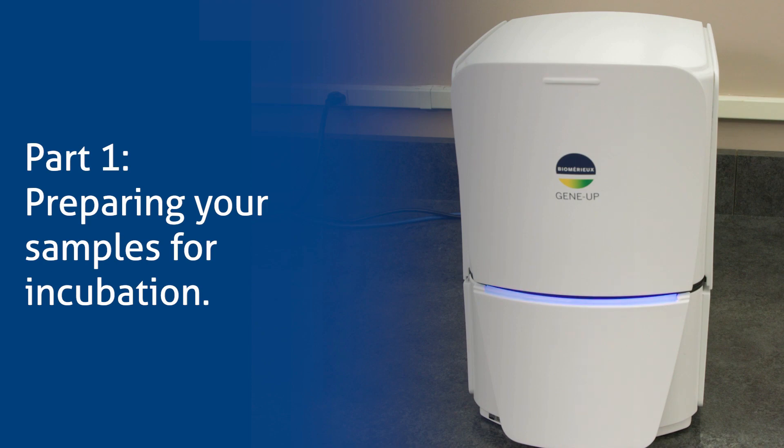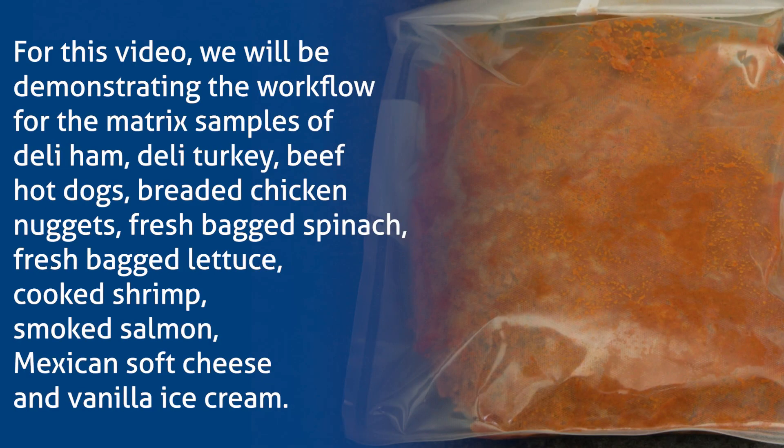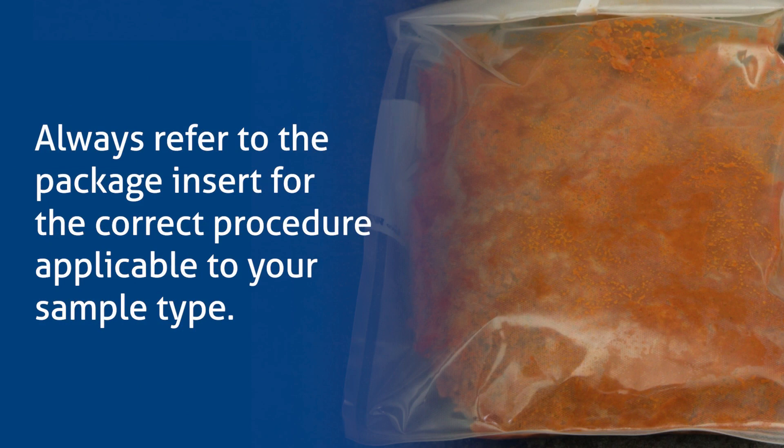Part 1: Preparing Your Samples for Incubation. For this video, we will be demonstrating the workflow for the matrix samples of deli ham, deli turkey, beef hot dogs, breaded chicken nuggets, fresh bagged spinach, fresh bagged lettuce, cooked shrimp, smoked salmon, Mexican soft cheese, and vanilla ice cream. Always refer to the package insert for the correct procedure applicable to your sample type.